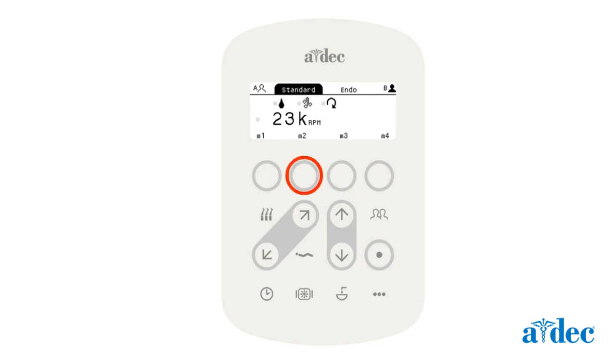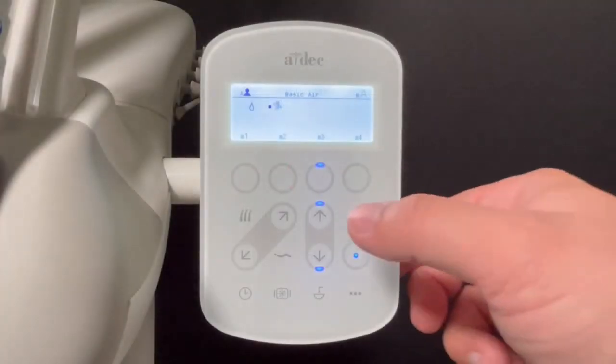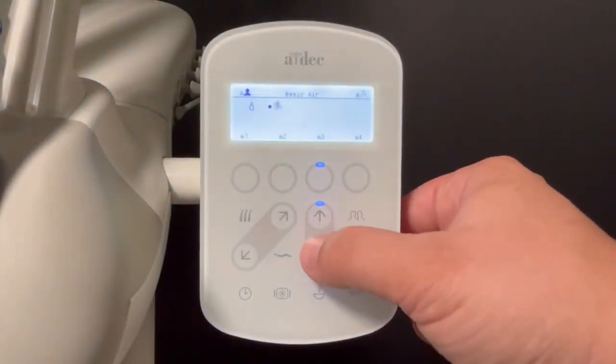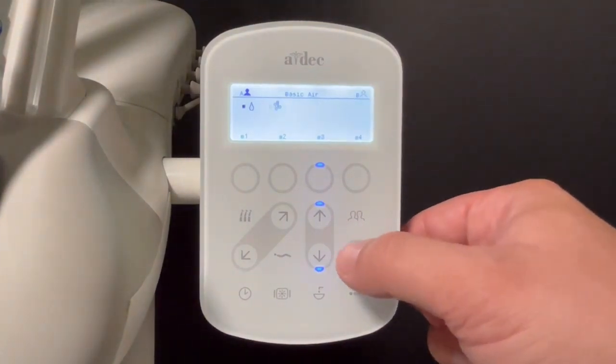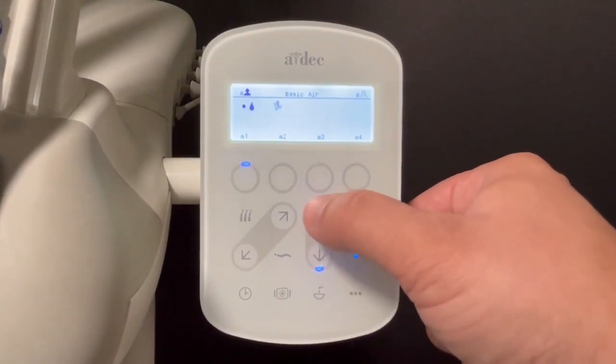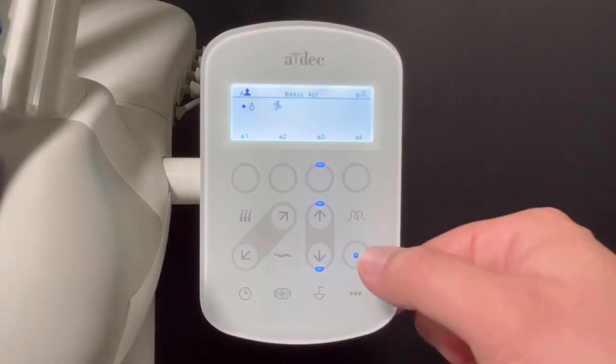Pressing and holding the soft key will save the current settings to the corresponding preset. The up and down arrows are illuminated to show buttons that are available to adjust for the selected item. Soft keys will illuminate to indicate if the changed parameters match an existing preset. Notice how the dot moves to show the highlighted function when the Adjustment button is pressed.